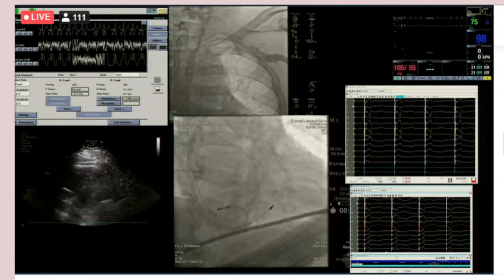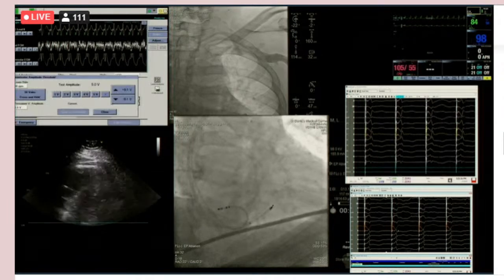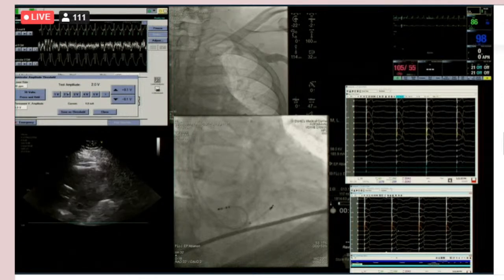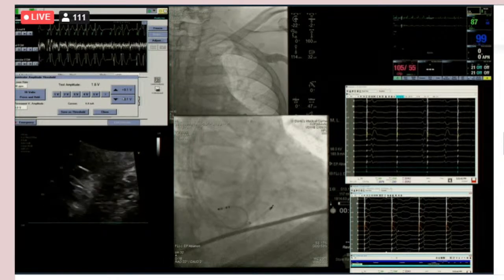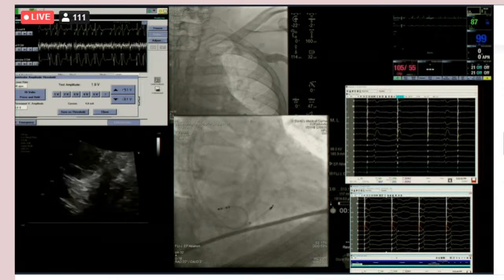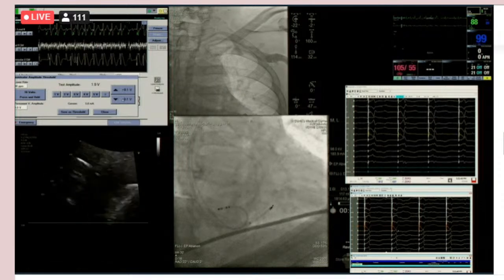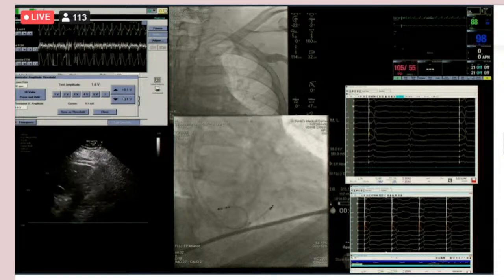That looks narrow. Looks good. Okay, go to 2. 487, 479. 2 volts. Decremental. Still here. Got it, yeah. Okay. No, that's losing. Right under 2. We're still losing it. Just 2. Got it. Okay. 9. Does it typically get better? That's actually getting, I think it is getting better.